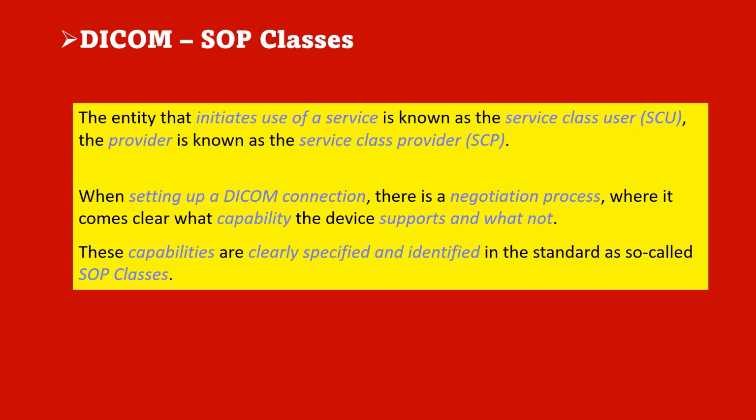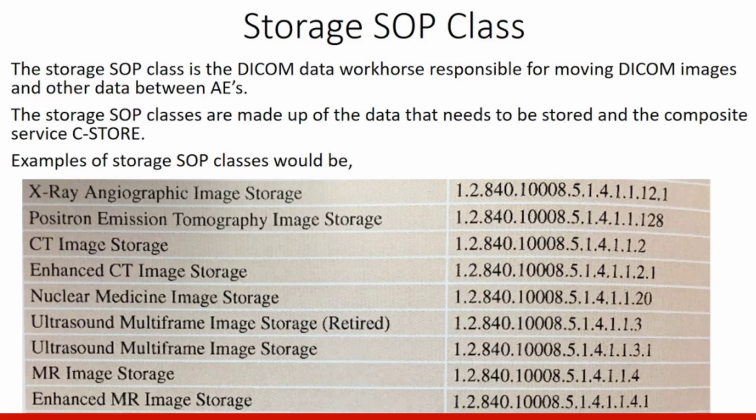When setting up a DICOM connection, there is a negotiation process where it becomes clear what capability the device supports and what it does not support. Those capabilities are clearly specified and identified in the standard as so-called SOP classes. The storage SOP class is the DICOM data workhorse.